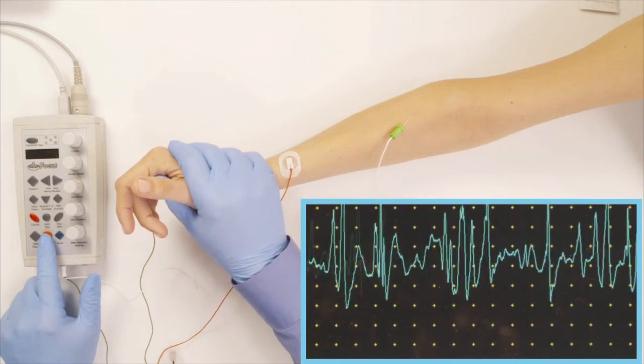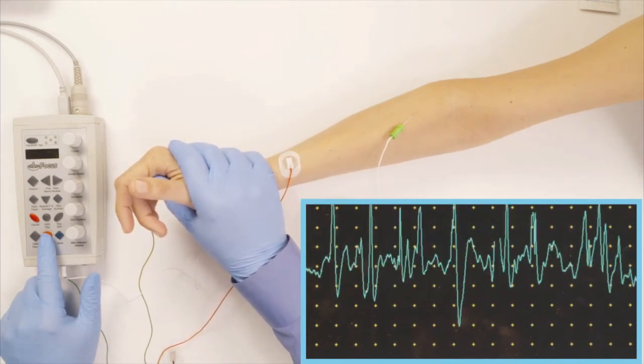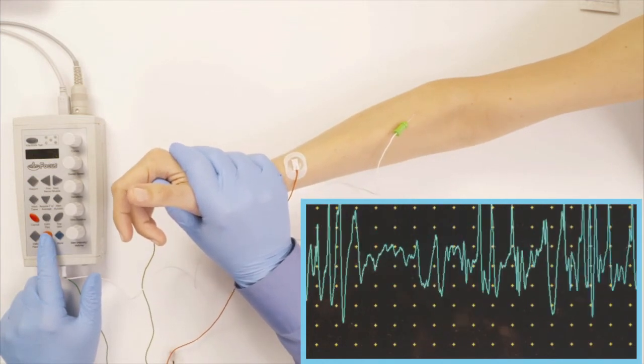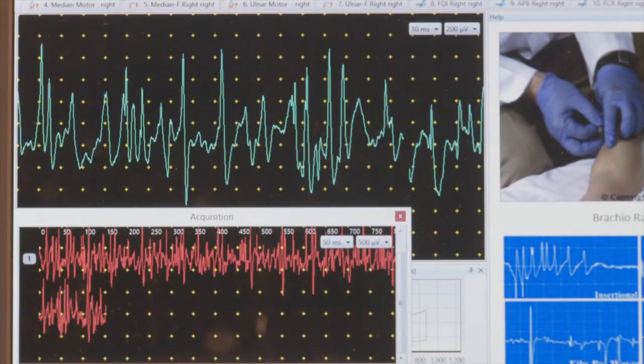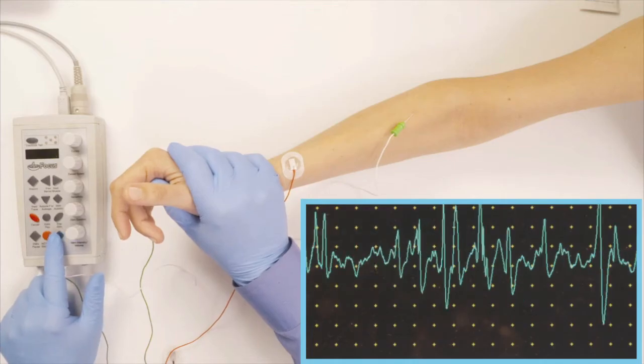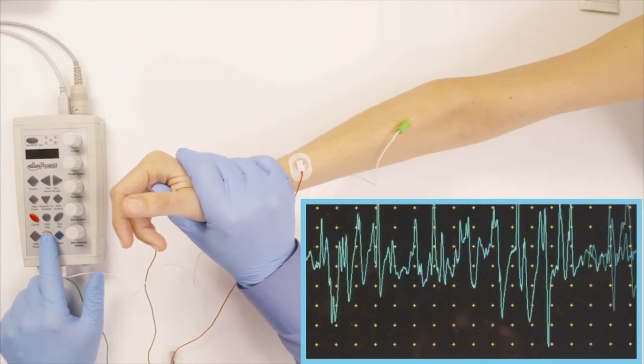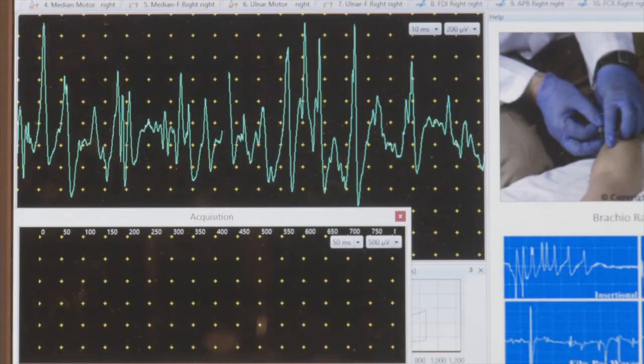And you can see the dots are at the left side of the cloud. Now raise the muscle, the arm up a little bit more. Some more. And again, I'm giving her resistance. Okay, still all the way.